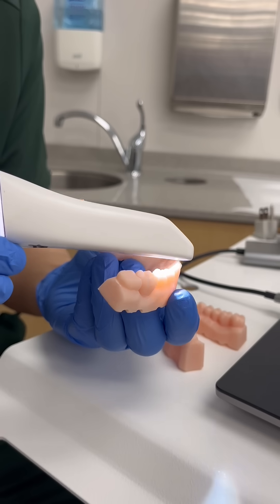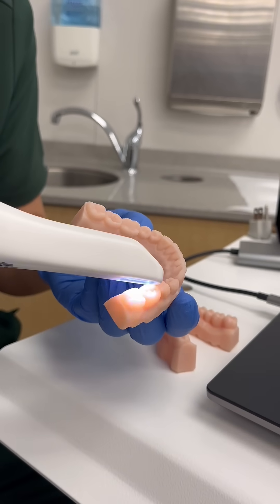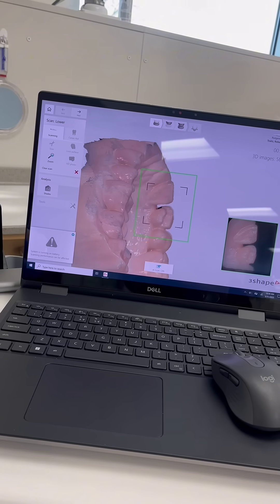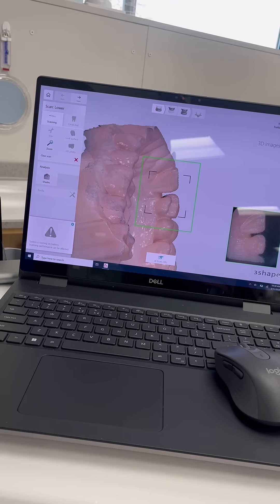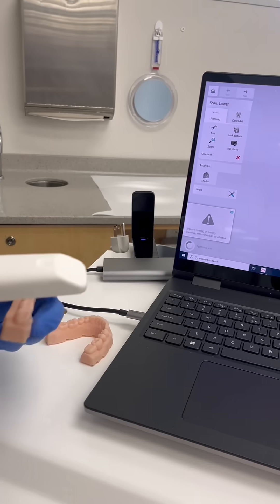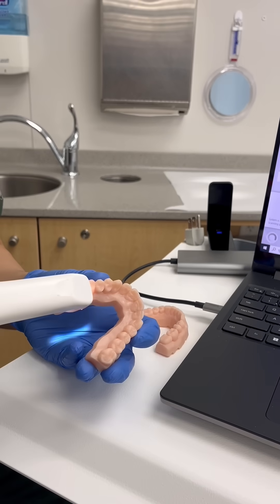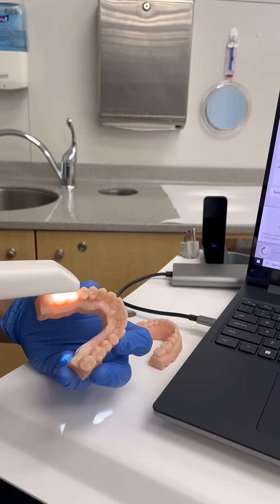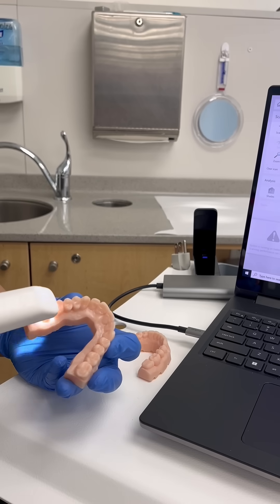One of the drawbacks to this one I would say is if the patient is edentulous. Well, if you have an edentulous patient and they have a very resorbed mandible, we need to retract the cheek and sometimes it gives us false results. Now I'm moving to the maxillary arch.